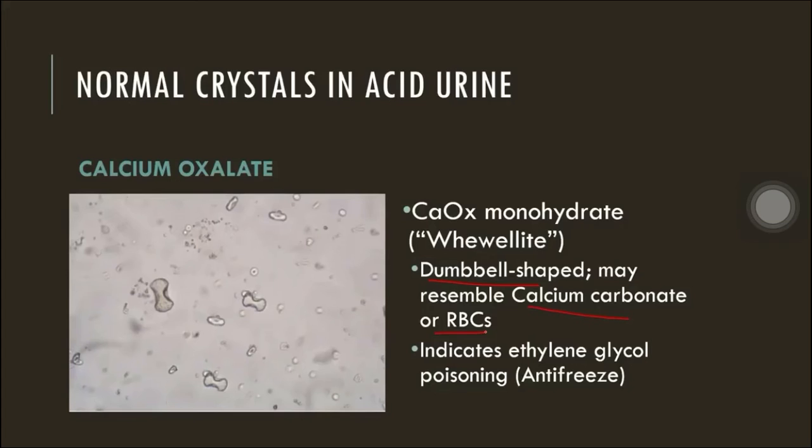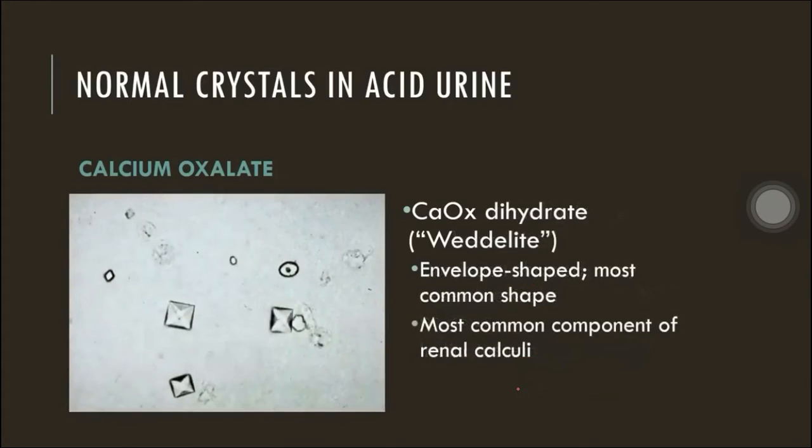Aside from that, calcium oxalate monohydrate may indicate ethylene glycol poisoning or antifreeze poisoning. Take note, it may indicate ethylene glycol poisoning. Next, we have another form, calcium oxalate dihydrate or weddellite.